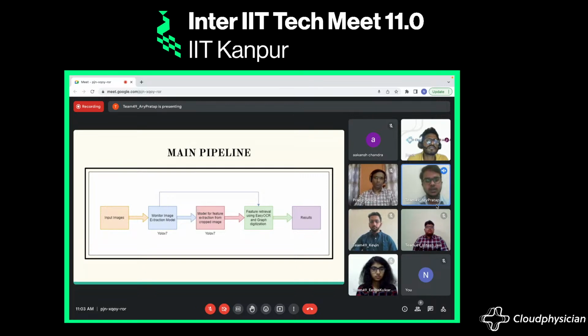Then the cropped monitor screen is sent to the second stage of the pipeline, which is the feature extraction model, represented in the red box. This feature extraction model takes the predicted output monitor screen from the first model, and then predicts the various vitals in that particular monitor screen. Basically, it predicts the bounding boxes of all the individual features in that monitor screen and stores these individual feature bounding box coordinates into a data frame.